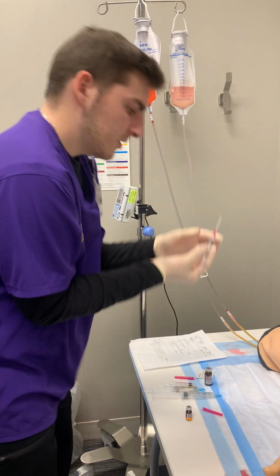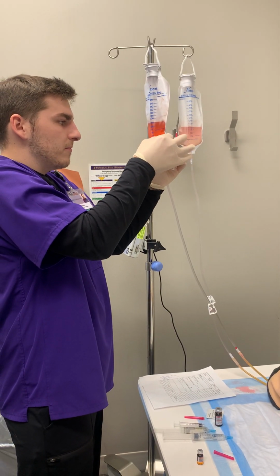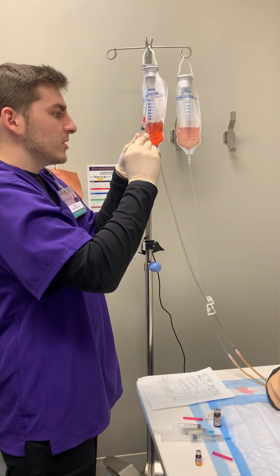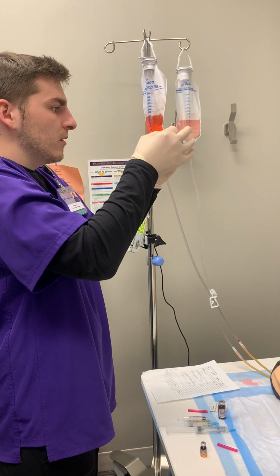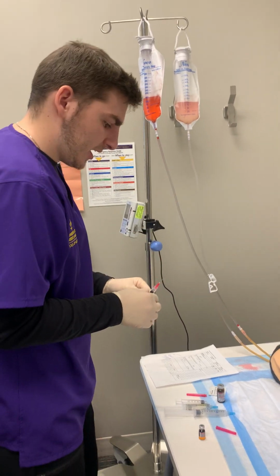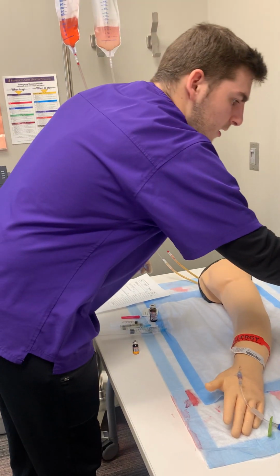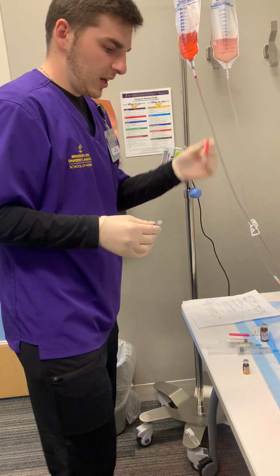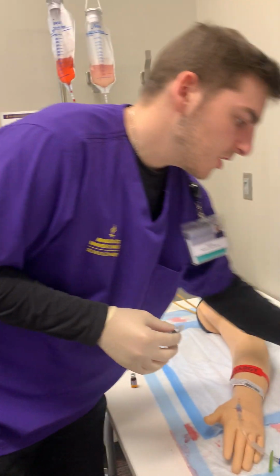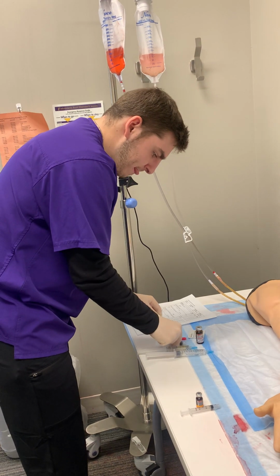Take that out. Just make sure that I get all these air bubbles out. Which I drew up a little extra because I knew there was an air bubble. Alright, then we're able to get that air bubble out. We're going to recap this and take this off. And then I'm going to get rid of this in the sharps. I'm going to keep this by my vial.